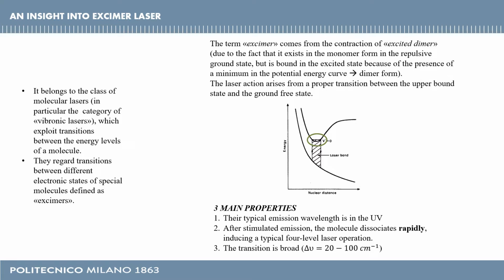Excimer lasers belong to the category of molecular lasers. In particular, these exploit transitions between different electronic states of so-called excimer molecules. If we analyze the potential energy curve of a diatomic molecule for both ground and excited states, we can explain the meaning of the term excimer.